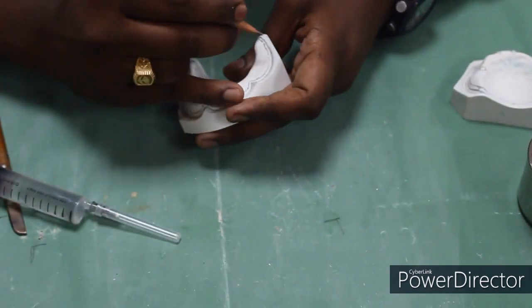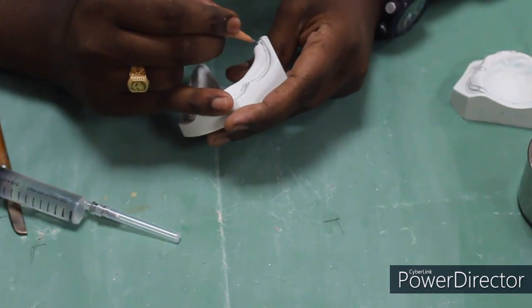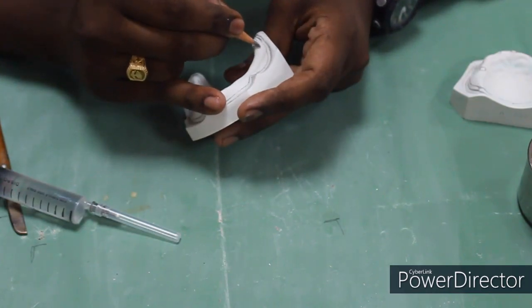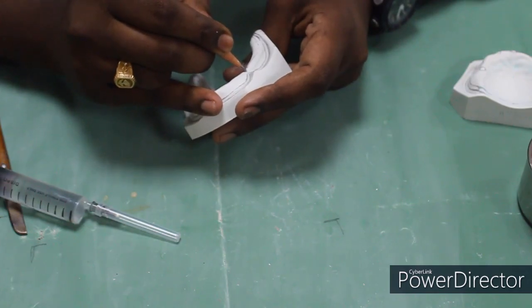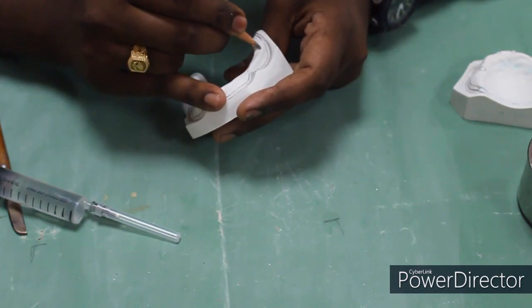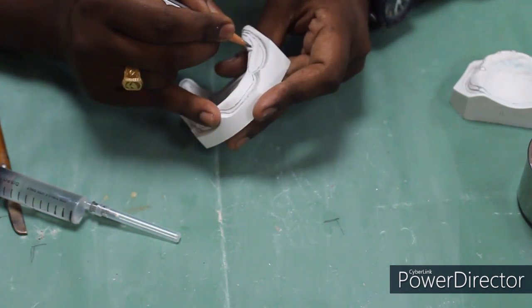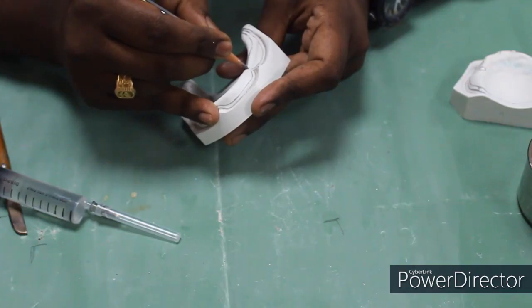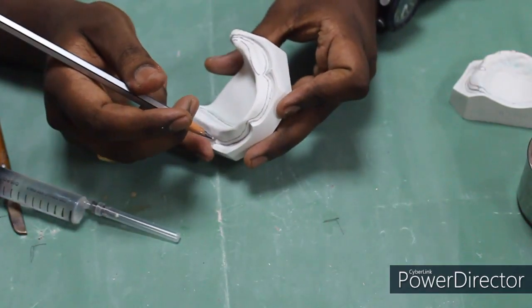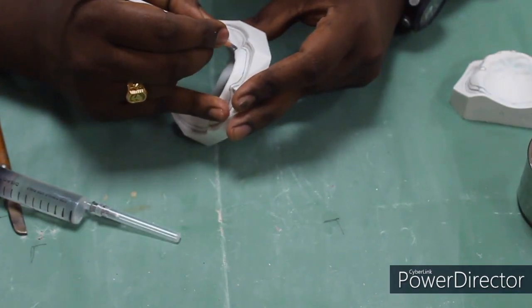Here the only variation is that we are following Boucher's spacer design now. So we are going to expose the buccal shelf area in this spacer outline. Why? Because that will be the primary stress bearing area, as we know. So we are going to expose this buccal shelf area in the spacer outline.